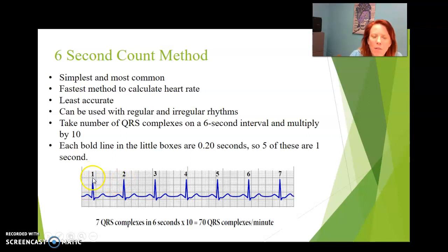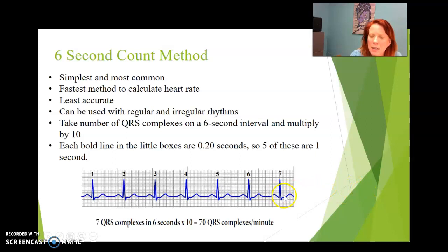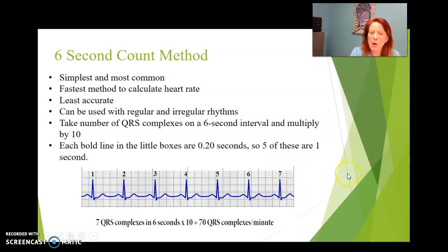The R value counts as one, then two, three, four, five, six, seven. So there are seven R markings in a six-second strip. We're going to multiply six seconds times ten to make it 60 — that equals a minute. Then we multiply our R values, which are seven in this case, so it will be 70 over 60. This counts as a whole beat, so it'll be 70 beats per minute, as opposed to looking at the seven full beats per six seconds.